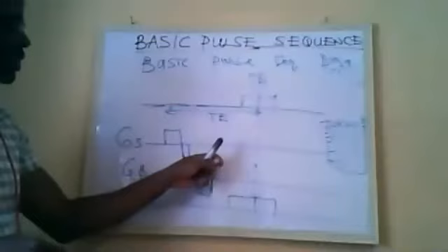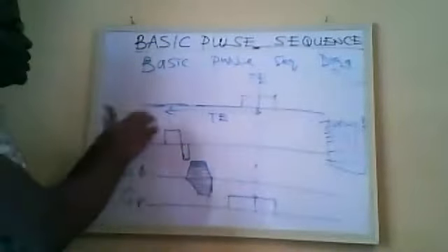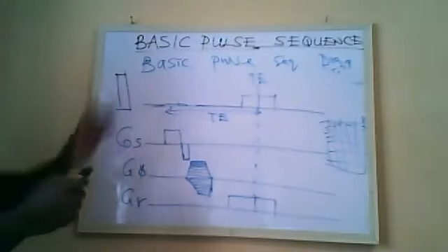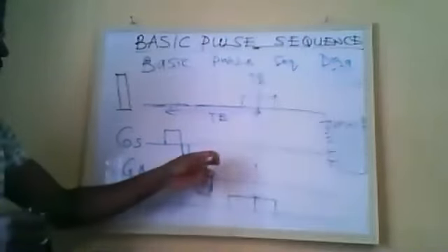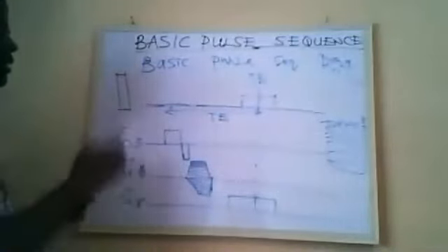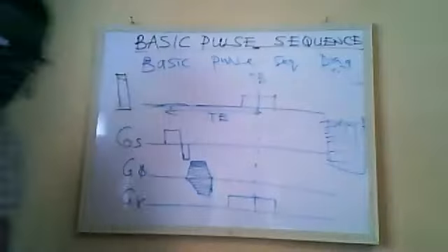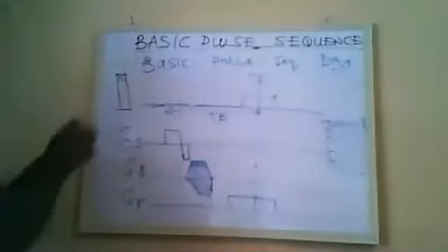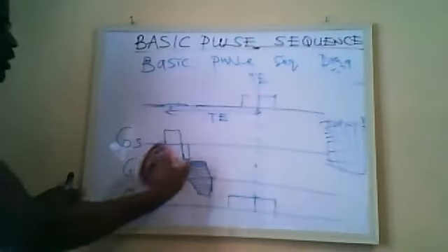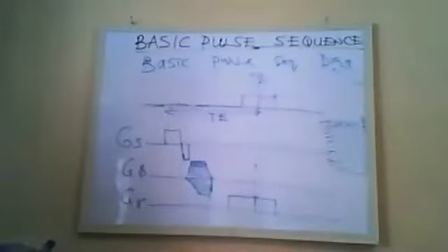So if you don't do this, we are just going to be getting information from all the slices, applying the same frequency to the slice. But with application of this gradient, we are able to get gradations. I mean, different portions on the slice will have a different frequency, hence being able to spatially locate them. So this is actually turned on after the slice select gradient. Then when we get to spin echo and the gradient echo, I think it will become clearer.